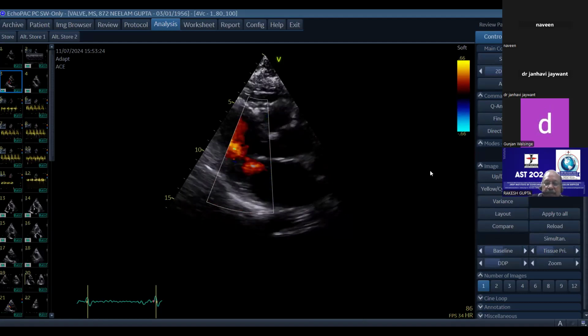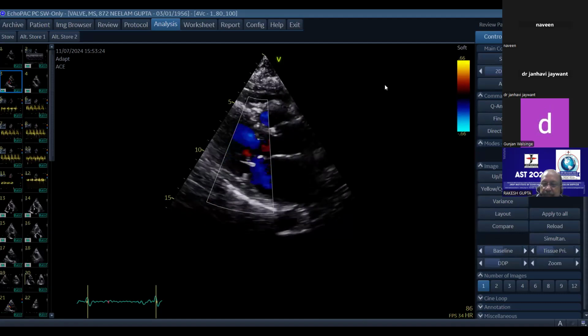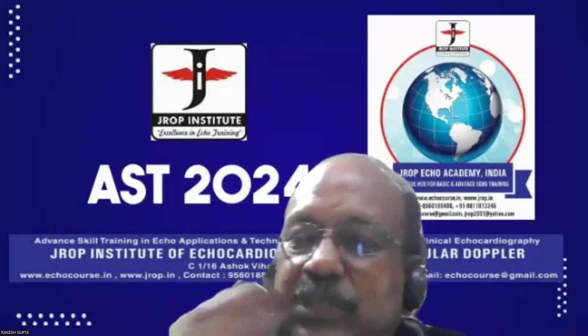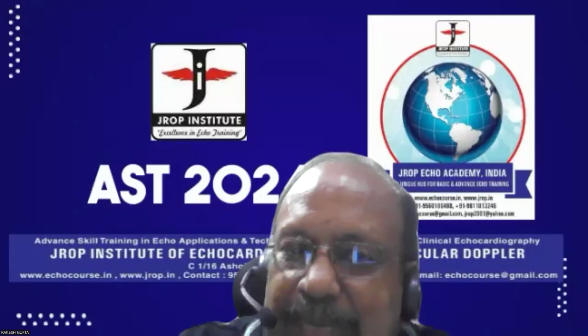Sir, one question. Go ahead. While calculating the stroke volume across the mitral valve, shall we take the VTI in PW Doppler or CW Doppler, sir? Whatever it is, if there's no aliasing, any one of them would be valid. Preferably take PW, or CW, sorry, because there is a protodiastolic gap between E and A. So how will we trace that? Just come to baseline and trace it up again.